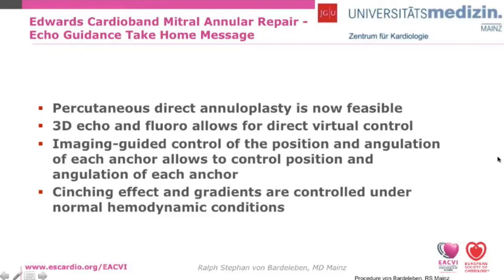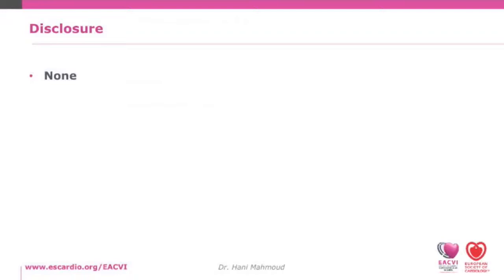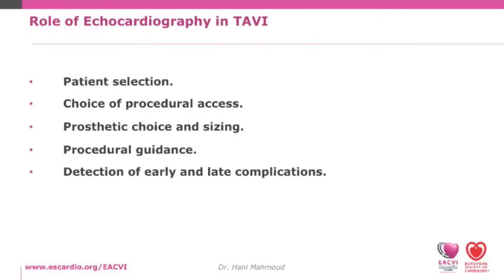I'm going to go very quickly in order to cover as much as I can of my presentation. The first part of my presentation will address the role of 2D and 3D TE during TAVI procedures. I have nothing to disclose. TAVI is very dependent on echocardiography, although some centers are now using fluoroscopy only to guide the TAVI.